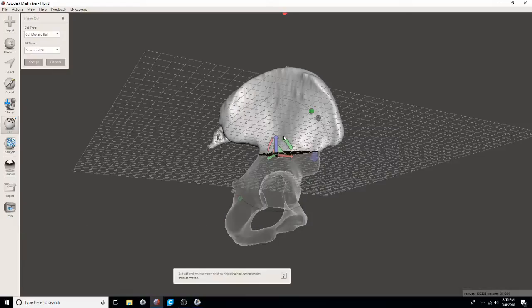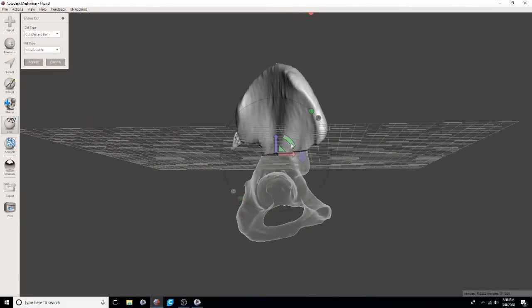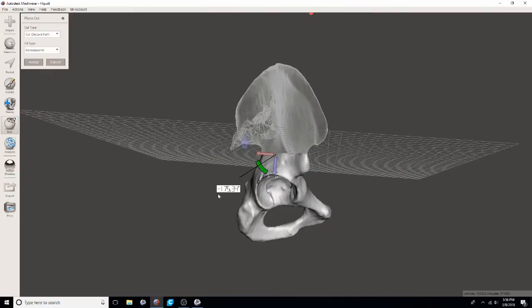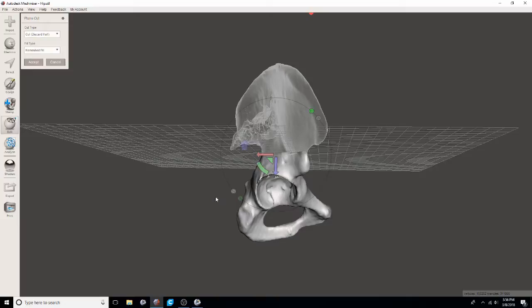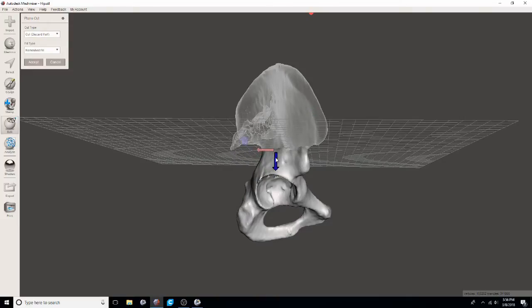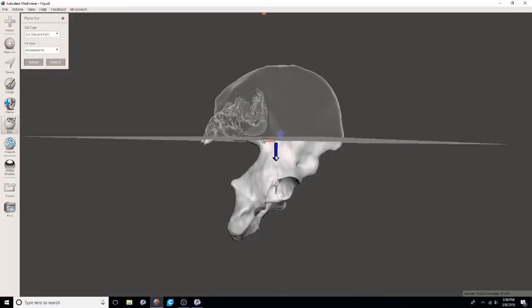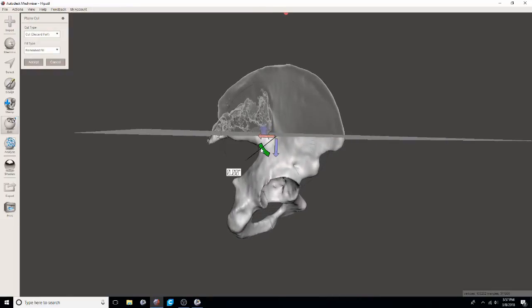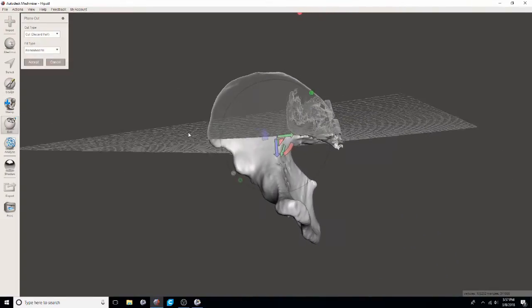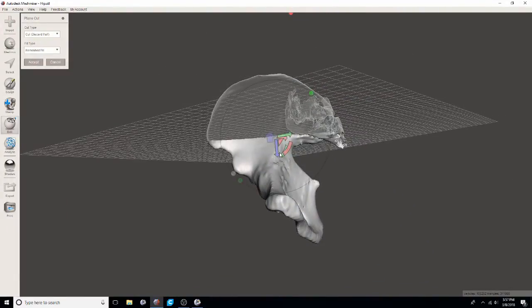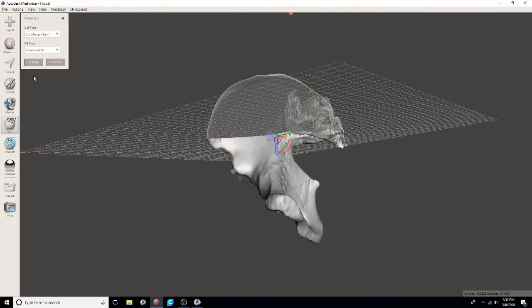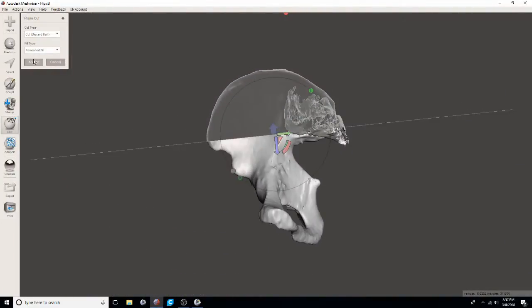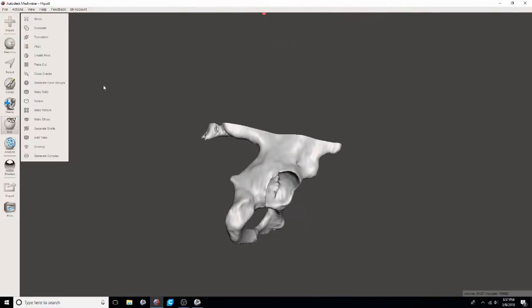You can then remove any portions of the model that you're not terribly interested in printing. So for this let's say we just want to really focus on that acetabulum. Then we can slice off with the plain cut tool the rest of the hip, that superior aspect, just because we don't really need it. It'll just increase the print time and not really add to our surgical planning or the educational purposes that we'll use this model for. Once we accept it we'll want to make sure that that top surface that we're cutting is going to be filled by mesh mixer. Most of the time it does a pretty good job but every once in a while I find that it doesn't actually close the surface. So just check it.